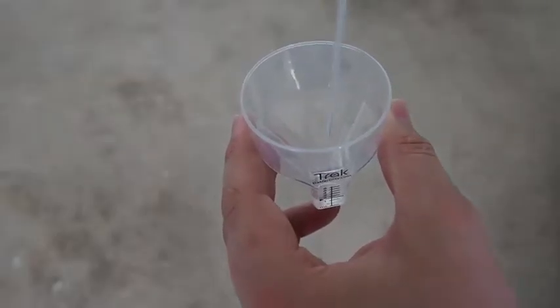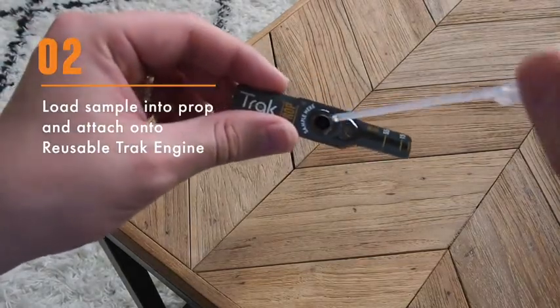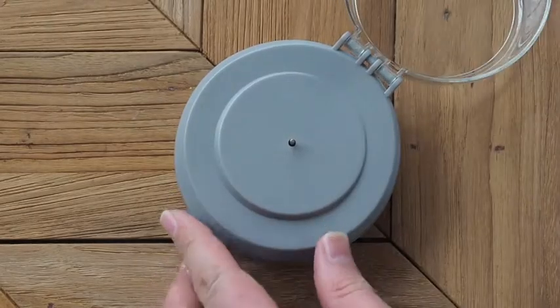Then, use the dropper to load the sample into the center hole of the prop. Don't forget to seal the prop with a Seal Before Spin sticker. Attach the prop to the engine and close the lid.